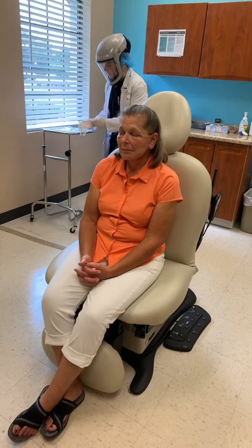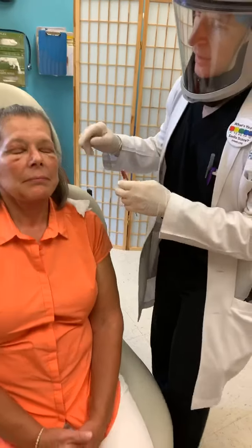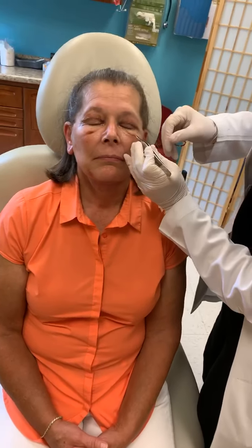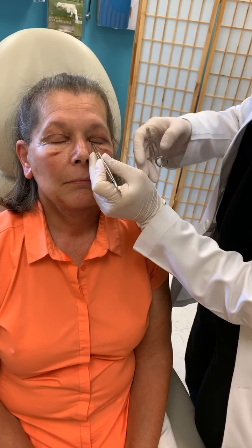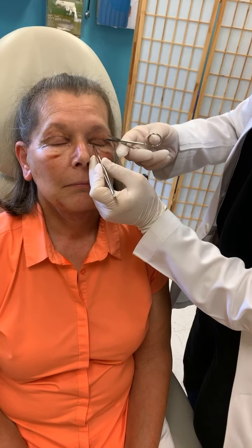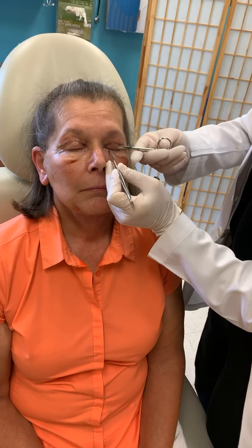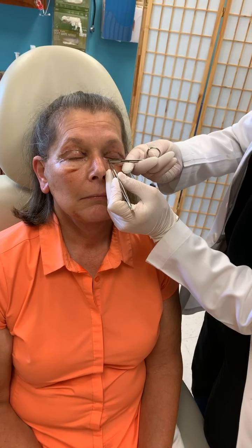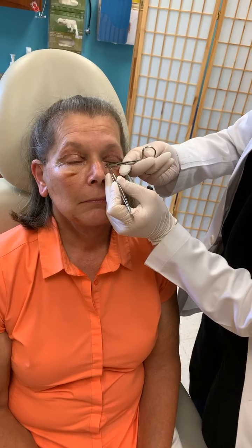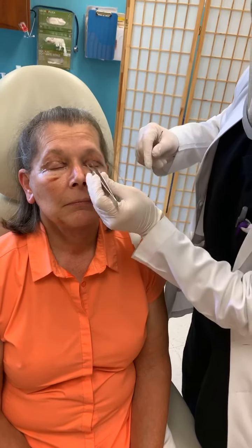So for this part, Caitlin, if you can come in a little closer, and what I'm going to do, these are the stitches. Let me have you rest your head all the way back. There's a little tiny knot on each side, and there's a little bit of swelling. So what I do is I grab one little knot here, and once I grab that knot, I trim, very fine little, might feel a little bitty pinch. Okay, so that one will pinch there. So then I grab this one here.